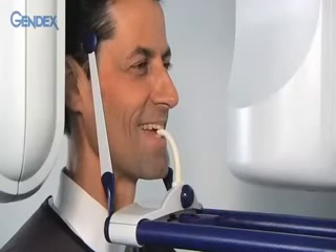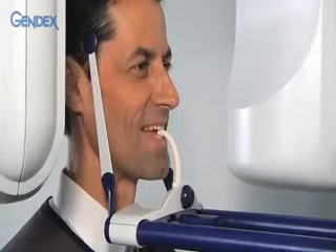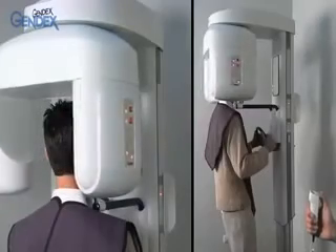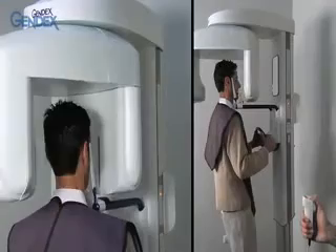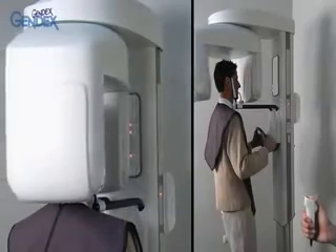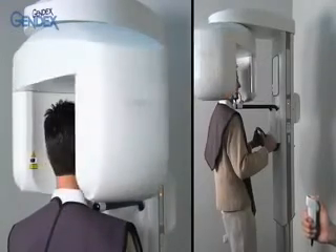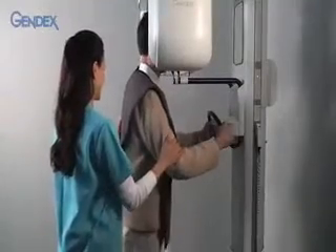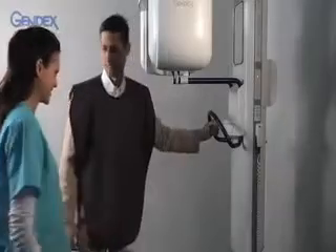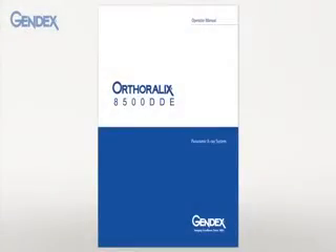Ask the patient to place his tongue on the roof of the mouth. Clear the area and trigger the exposure with the hand switch button. The patient should remain still for the duration of the exposure. Then open the head supports, ask the patient to release the bite guide, bring his feet back to a normal position, and release his grasp on the handles. Guide him out of the unit. Follow the instructions in the manual for decontamination of system parts.